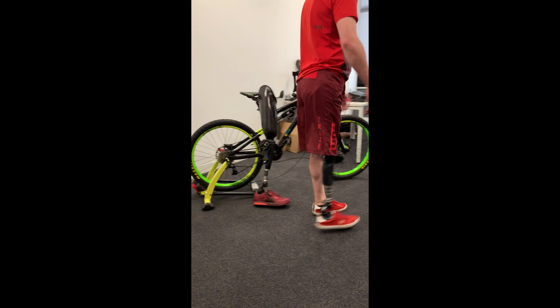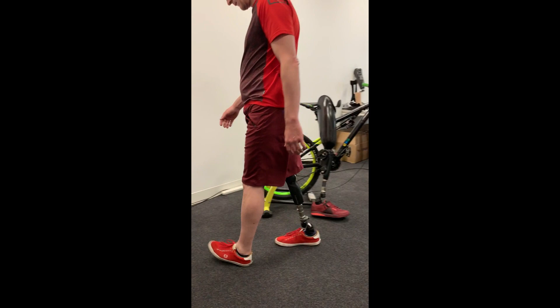Interestingly, this knee knows whether somebody's on a bike or whether they're walking as well. I don't really know how that works, but if you're on a bike it'll cycle completely freely.